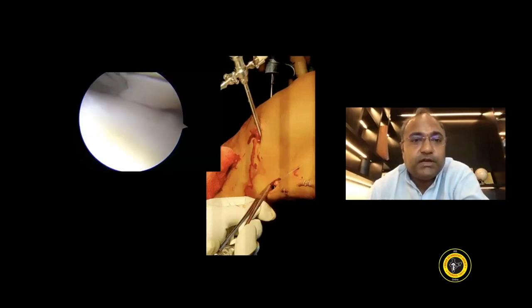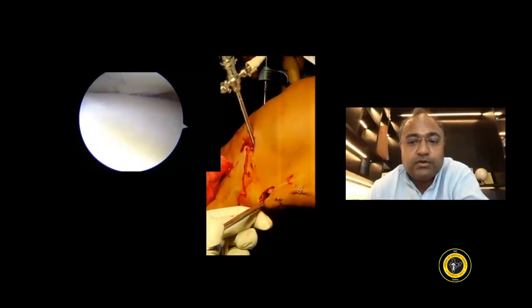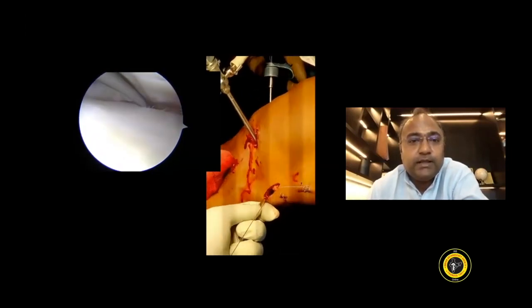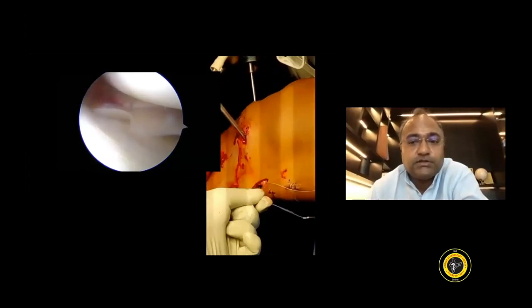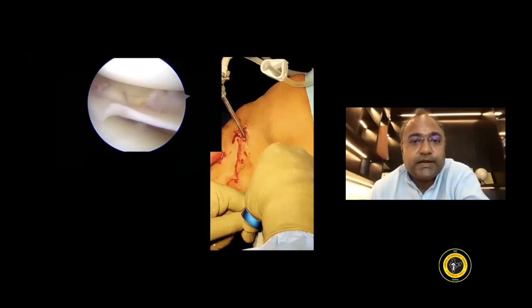The first needle is passed through the meniscus tissue, drop the knee to about 60 to 70 degrees of flexion, and that will allow the needle to come out, exactly being deflected from the spoon, and your assistant can pull on that needle. The second needle is passed to the capsular surface, again being pulled by the assistant, and you can see restoration of the meniscal flange. I tie the sutures immediately so that there is no confusion at the end of the procedure. This is another stitch being passed through the upper surface. It's a horizontal mattress stitch which is being passed, retrieved from behind, and immediately tied.